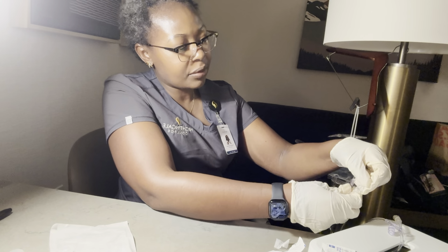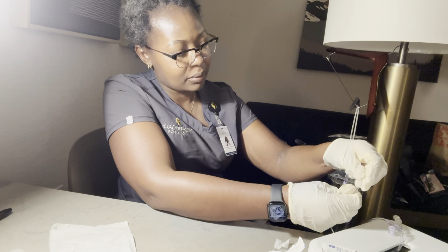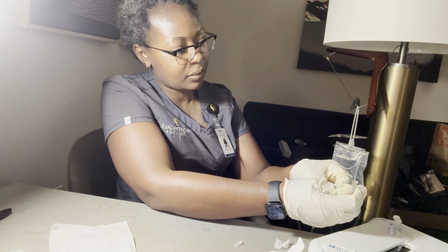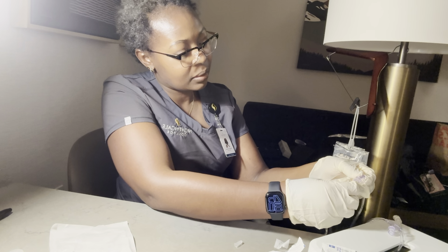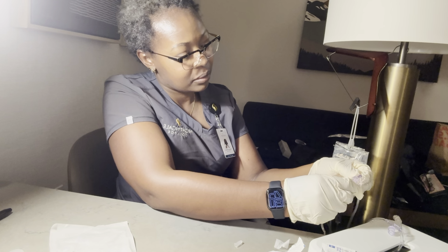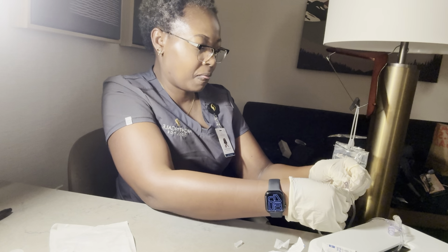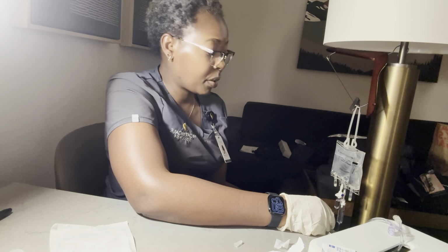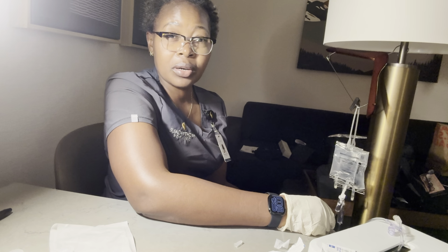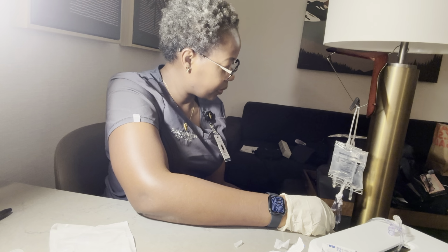I'll go ahead and remove this and connect it to the Y tubing. I'll then do my timing to make sure that I have 100 drops per minute on my secondary line.